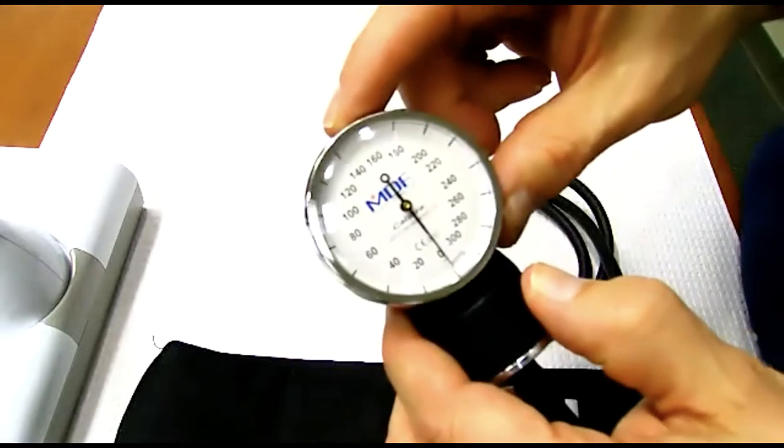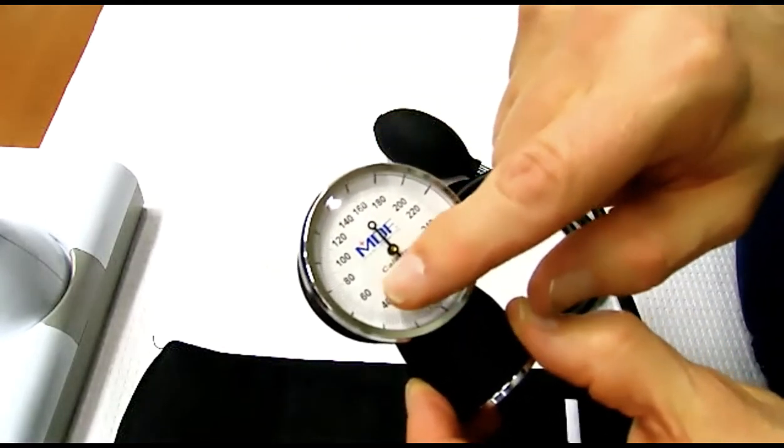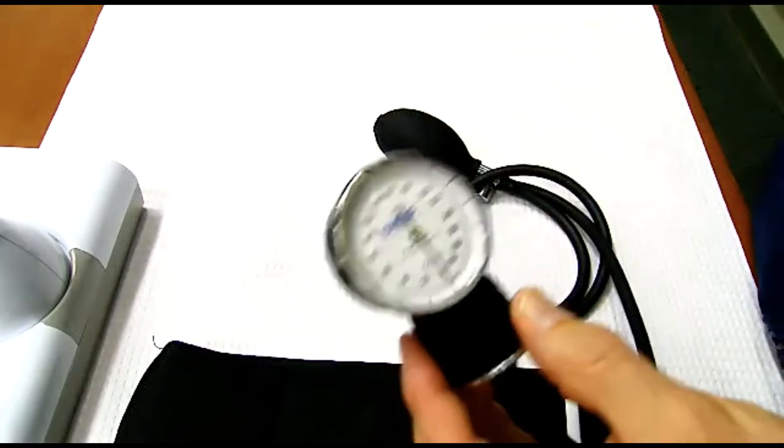Now, let's talk about the numbers. This is where you're going to read to get your values. Wherever that little pin is pointing, value number-wise, is going to be the reading that you take. So let me ask you this: what are the units of blood pressure?